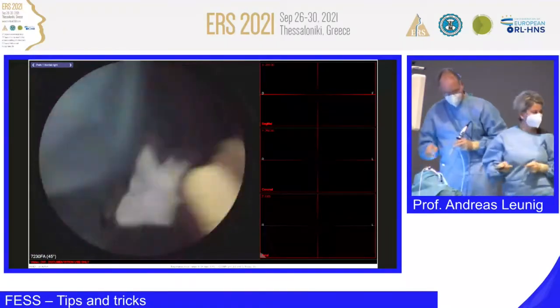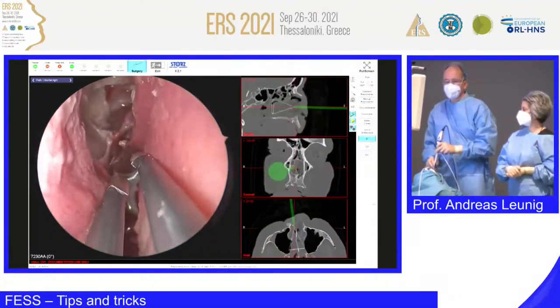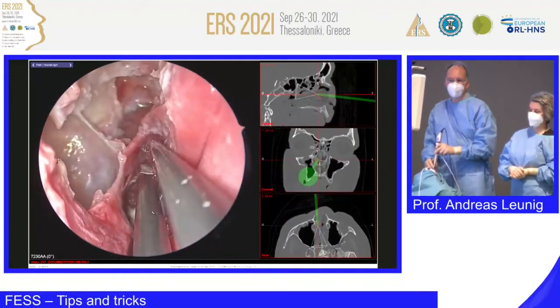Are there any questions in the meantime? In case you have a bleeding, have a look here. You can take this, it's a suction bipolar. You can go there and make bzz, bzz, bzz, and then you can deal with your bleeding.